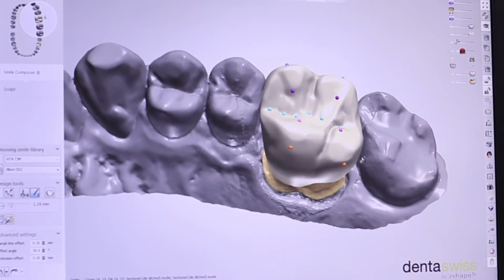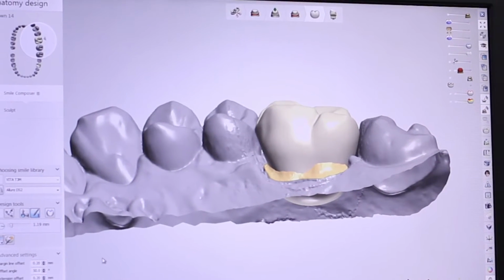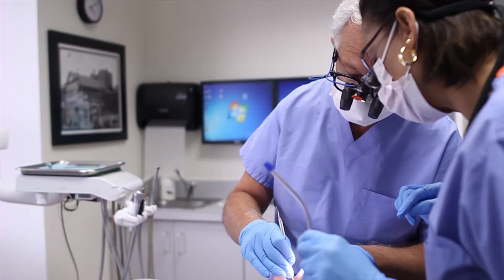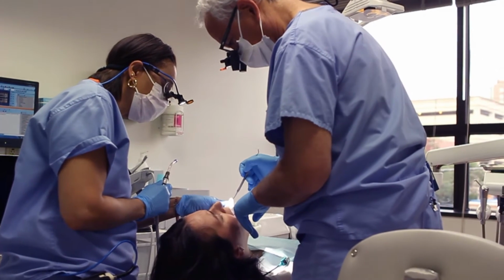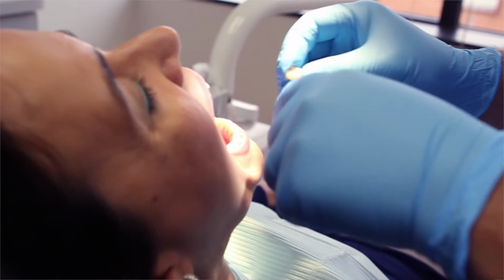And the computer, because it's placed the implant, can also provide for us a temporary restoration. So that when we go to the mouth with the patient, we are able to provide a very simplified 1, 2, 3 step approach to implant dentistry, causing far less trauma to the tissues because we know where the implant should be. We just punch a hole through the gum tissue, put the implant in. Number 2, the tooth fits precisely on the implant, we screw it in.